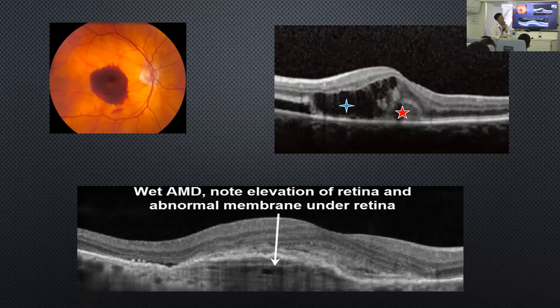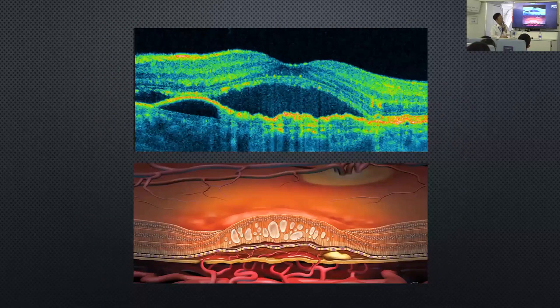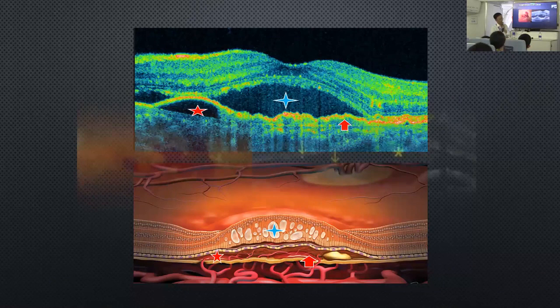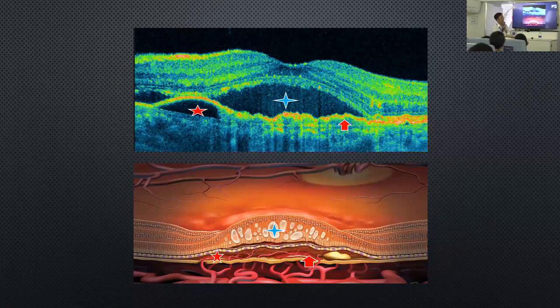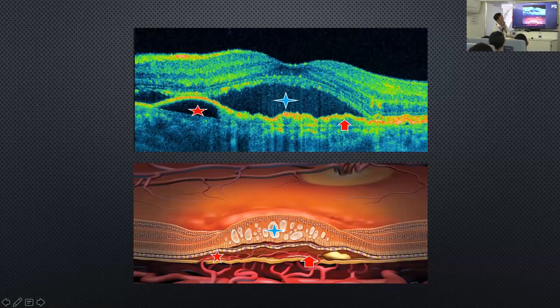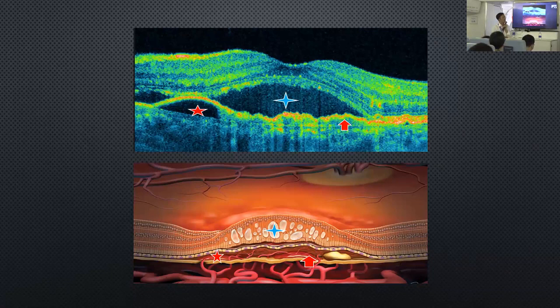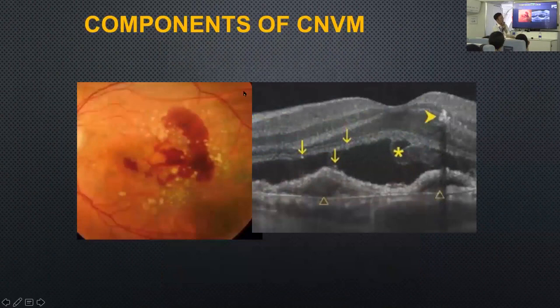You can see the correspondence between the cartoon illustration and the OCT pictures. There is subretinal fluid, a pigment epithelial detachment, a choroidal neovascular membrane with blood, and intraretinal fluid. Here's another example showing blood sticking to the undersurface of the retina, intraretinal fluid, a choroidal neovascular membrane with blood, and pigment epithelial detachment.